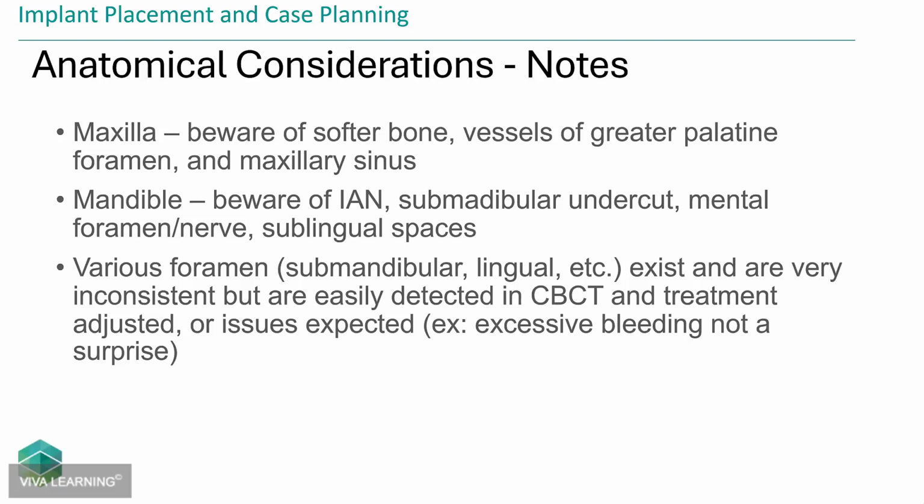And then you have some cases in the mandible or anywhere where shallow implants turned out to be really problematic, and more buccally or facially placed implants turn out to be the ones with the biggest problems. So if you're going to favor anything, favor the lingual, favor the palatal, because those are going to be much easier to compensate for that displacement than other areas are.